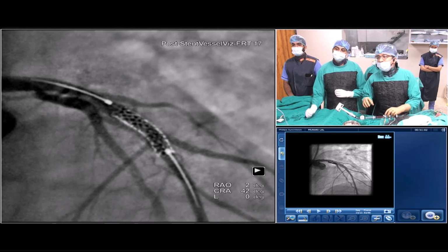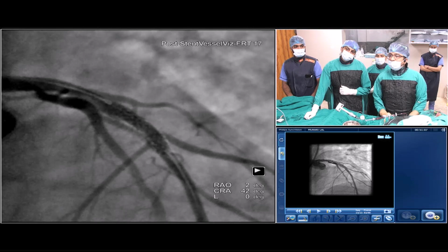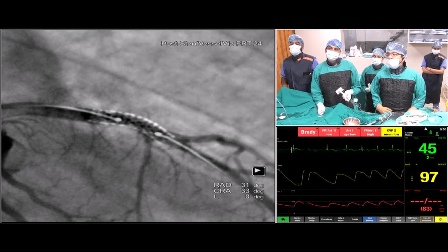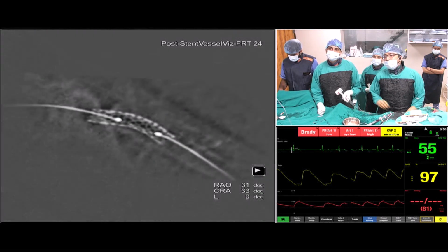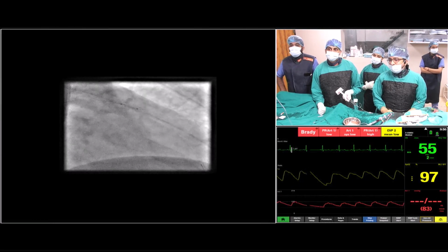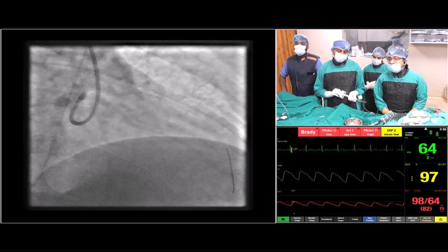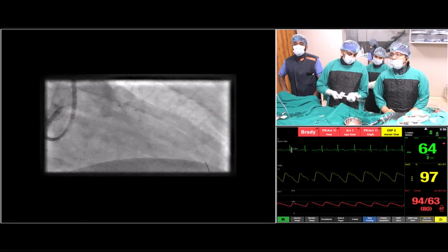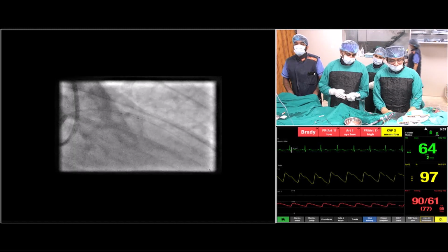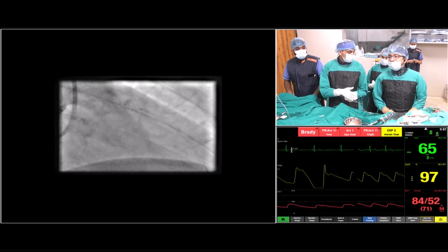The stent looks well expanded and very well apposed with the vessel wall. So there is a bend. I think the stent is very well expanded. This is a bend, and I think we have got the desired result. I will just post-dilate slightly more here at the lesion site. Just inflate. 10, 12, 13, 14, 15, 16, 17, 18. Down. Yes. So 3.5 balloon. I think we have got the desired result.